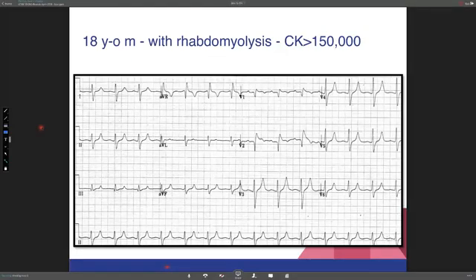Interestingly, in that very case report, Khalid, and inshallah I'll send it to you and Yousef to look at as well, the case of Brugada type EKG and hyperkalemia was also a rhabdomyolysis case. So I cannot find a way to link rhabdomyolysis, because eventually you get high potassium and cause this. So I don't know if there are any other factors released in rhabdomyolysis that can predispose. I have no idea. It's very interesting to note that both cases, at least this case and that case, were due to some rhabdomyolysis. I'll send you the report, and if you can think of anything interesting, let me know. That was the cause of his rhabdomyolysis.